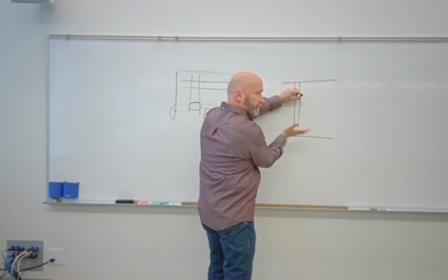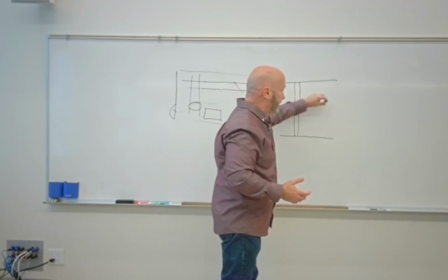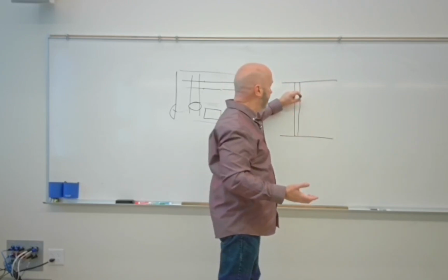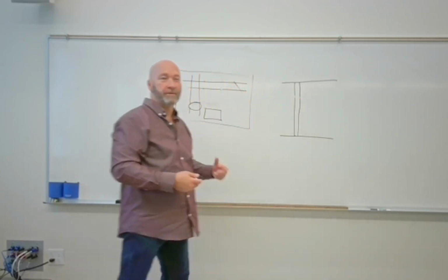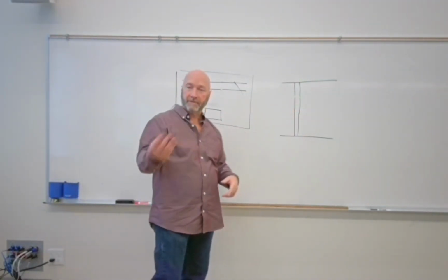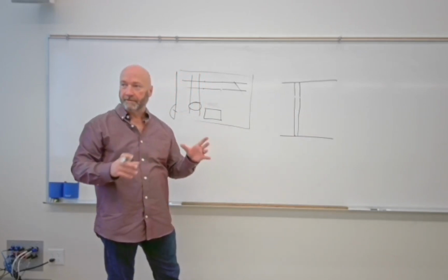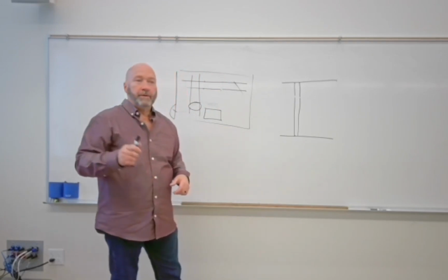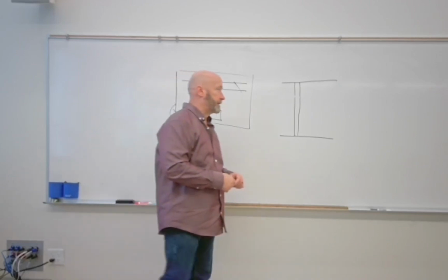is suspended from an arm that sticks out from that. So the table would be down here, right? So your movement is pretty much limited to this, plus you can swivel the arm so that you can take an X-ray on the wall, right? You can do some pivoting in this direction, but it's very limited, right? So they're a whole lot cheaper. This is where you're going to probably see some of your single phase machines. We said you could identify single phase machines by the presence of the line voltage compensation circuit being visible on the control panel, but also by the timers, right? The timers were going to be in increments of 1/120th.